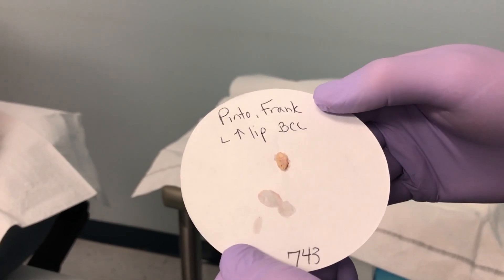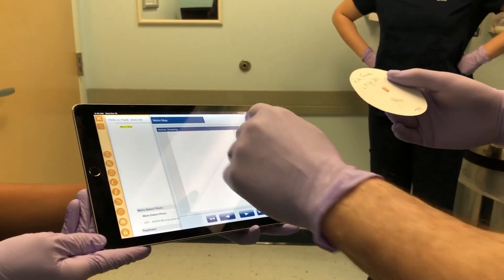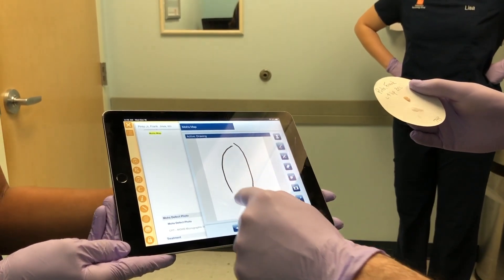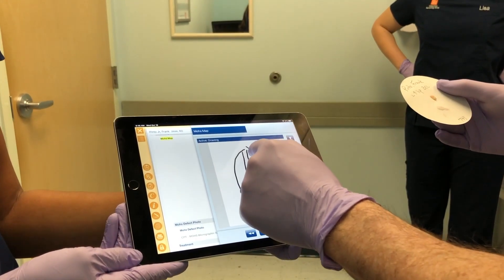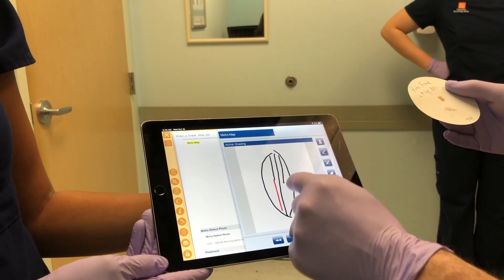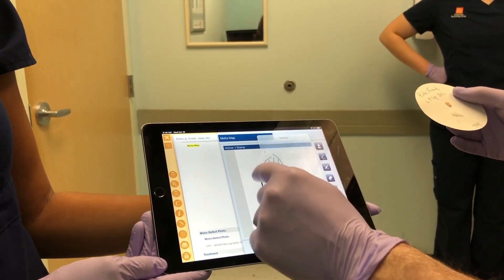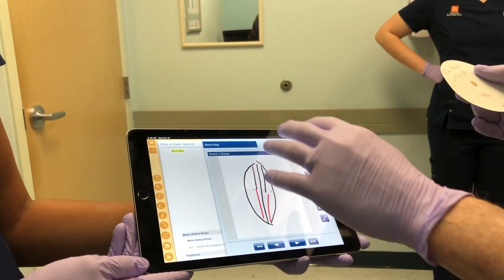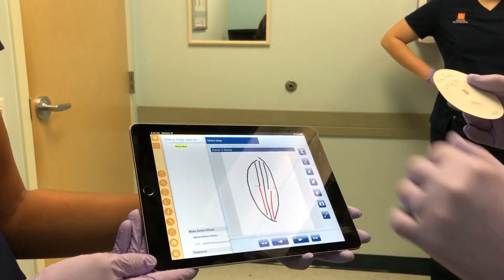Didn't feel a thing. That's our tissue on the filter paper, and we will transport it to the lab. This is how we're going to process the tissue in the lab — it'll be bisected into two pieces. The top half will be inked with black ink, the bottom half will be inked with red ink. Each piece is labeled piece one and piece two. This allows us to look at the tissue under the microscope and precisely mark where there's residual tumor.